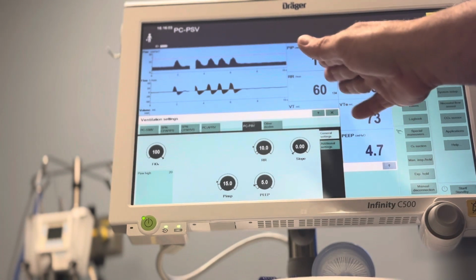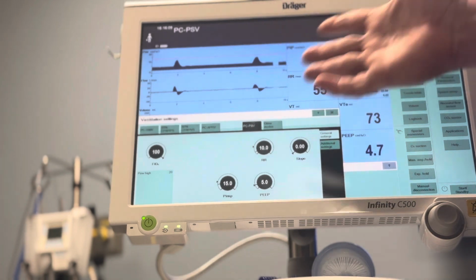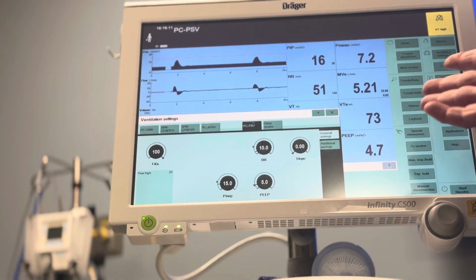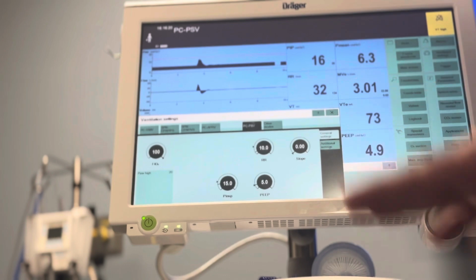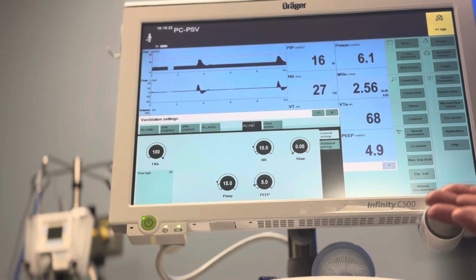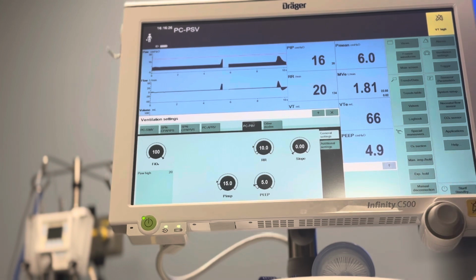And now, we have a minimum rate of 10. So he ventilates at the rate of 10, right? But you can see the vent is not alarming apnea. It's not telling anybody that this is happening. There's no alarms going off, at least pertaining to that rate. So I can set my low minute volume alarm if I wanted to be notified that this was occurring, or I can set it where I don't get notified.